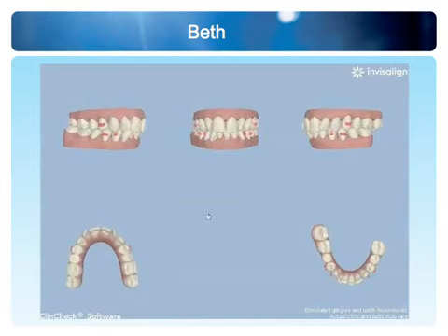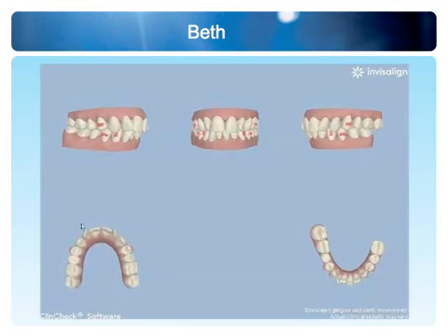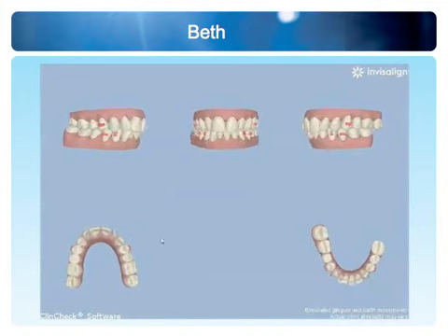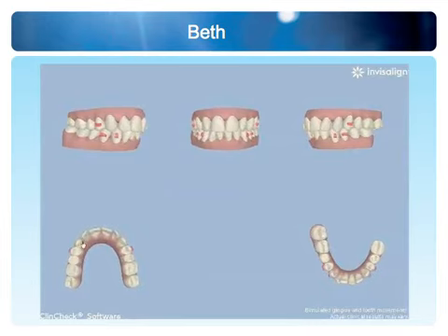The canines will draw back to their position and upper laterals will be placed. And now we have a wider arch, so now we have established a proper arch width. We now have a better arch form. Now we have that Roman arch we were looking for, following those cusps and incisal edges all the way around.